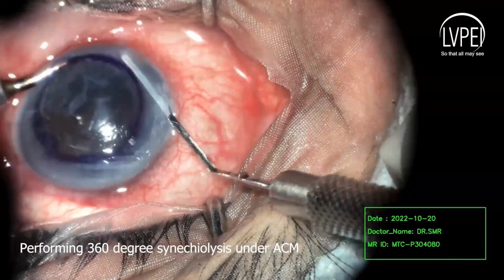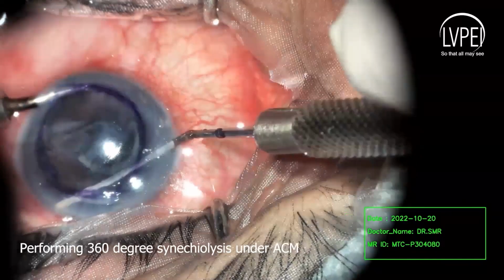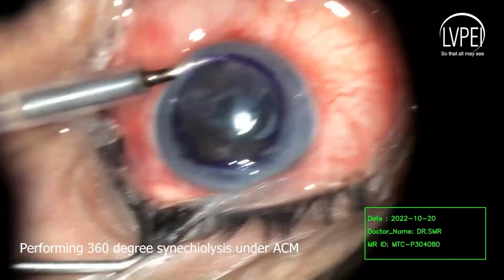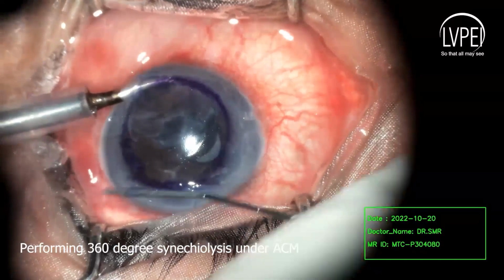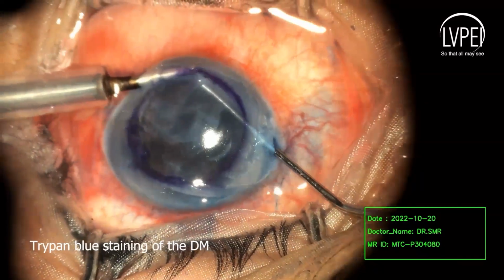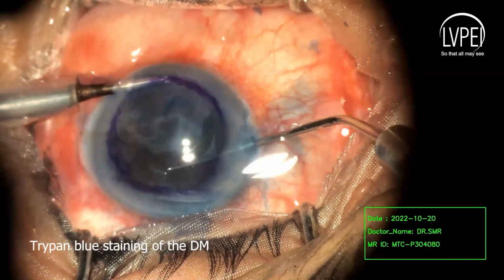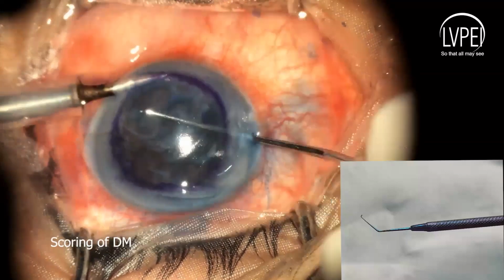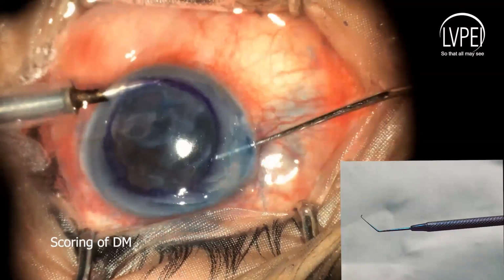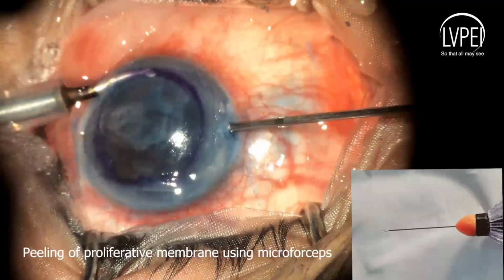A 360-degree synechiolysis was attempted using an iris spatula under the artificial anterior chamber maintainer. Trypan blue staining of the Descemet membrane was done, followed by scoring of the Descemet membrane using reverse Sinskey hooks. Peeling of the proliferative membrane was done using micro forceps.